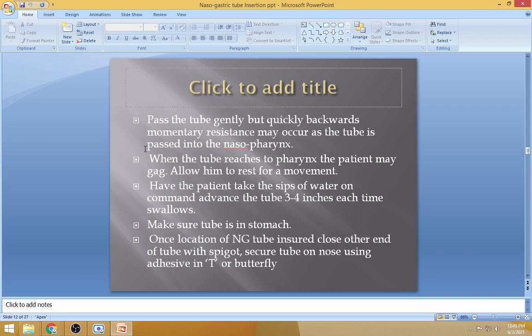The face will become a little bit dark, because when there is no oxygen, we can make it out. That will happen immediately, and the patient will show difficulty in breathing and restlessness. Immediately we will come to know when the tube is not going inside the right track.